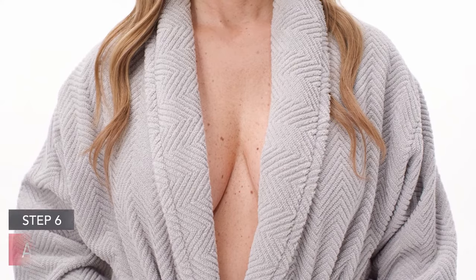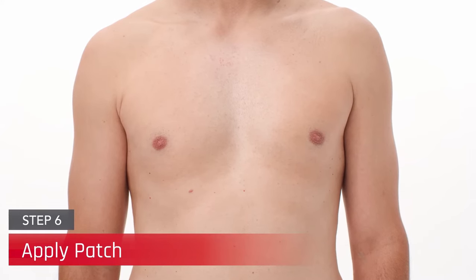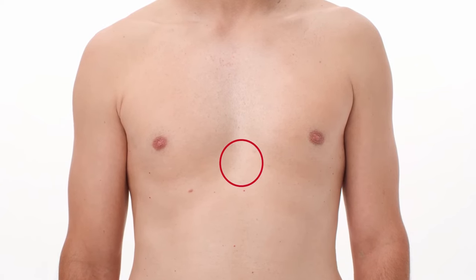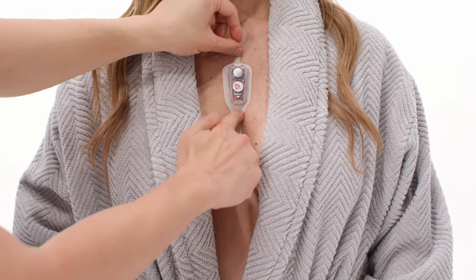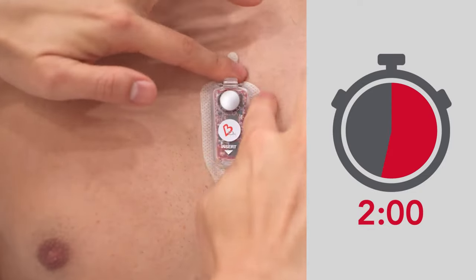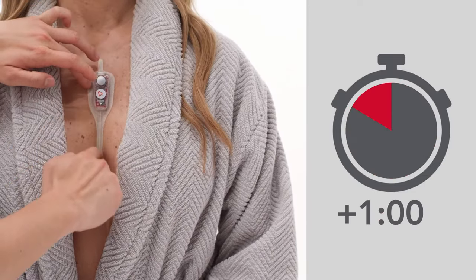Prior to applying, ensure the chest is completely bare and free of clothing to optimally place the CAM patch. Locate the xiphoid process at the bottom of the sternum and apply the CAM to the patient's chest with the bottom part seated over the xiphoid process. Press along the entire edge of the patch for two minutes and then rub firmly around the edges of the patch for one minute to ensure proper adhesion.